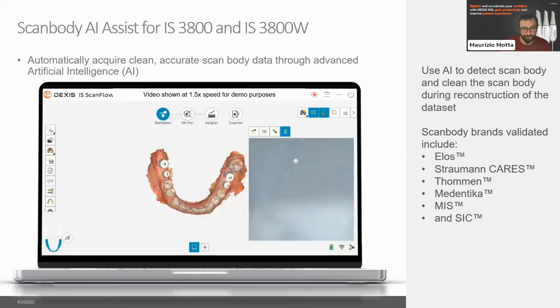So it's actually better to let a proper dealer certified technician look at your scanner and your laptop, and they have all the instructions to verify that. And if they cannot, they can always contact our support team. We have a dedicated support team for all our certified dealer technicians that can help to identify any problem with the scanner or the PC.